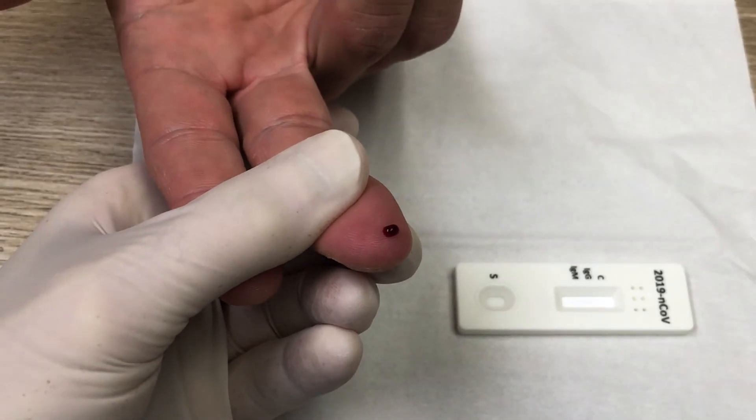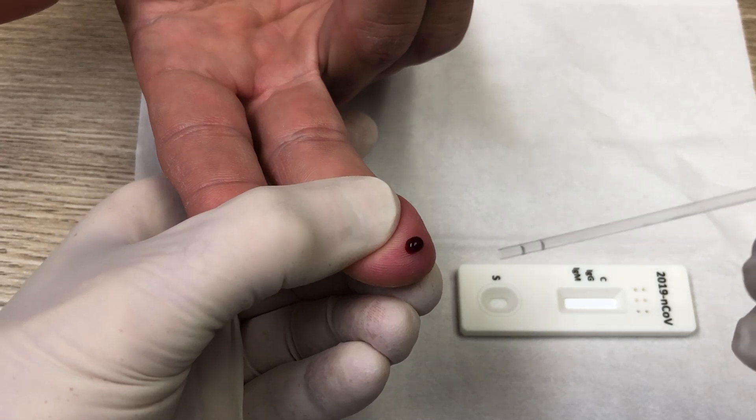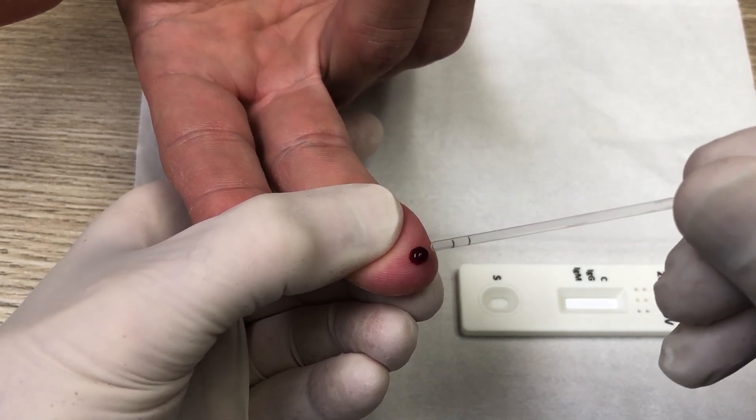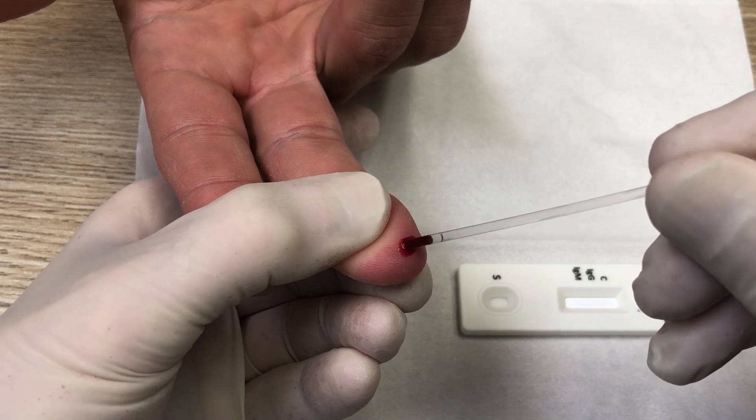When you get the drop of blood, you take the pipette, and you just squeeze the other end and pull in some blood up to the second line mark.